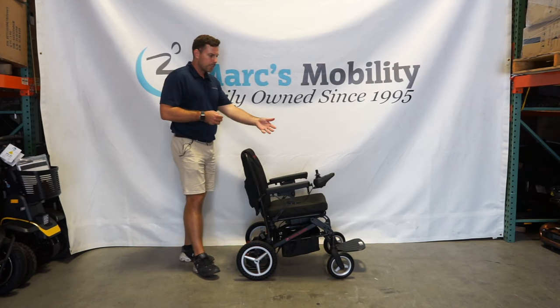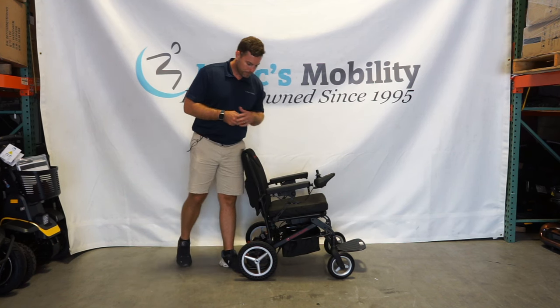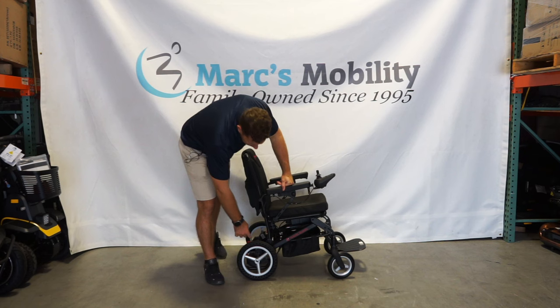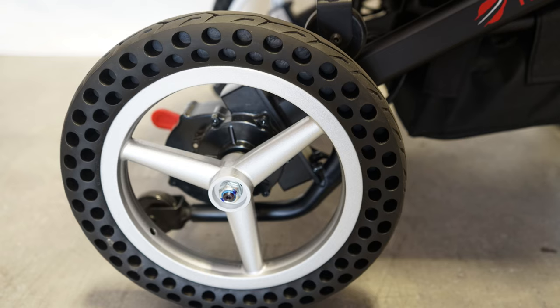You do have multiple different speeds on this unit and a battery gauge on here as well. This unit comes with solid tires — 8 inch solid tires in the front and perforated solid tires in the back, about 12 inches. The perforated tire technology is just to give you a little bit of a softer ride.